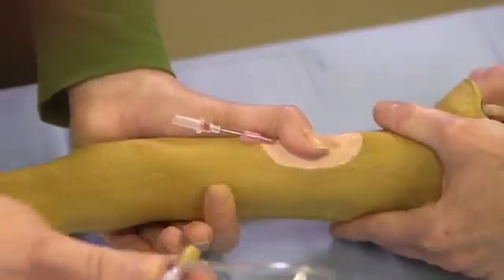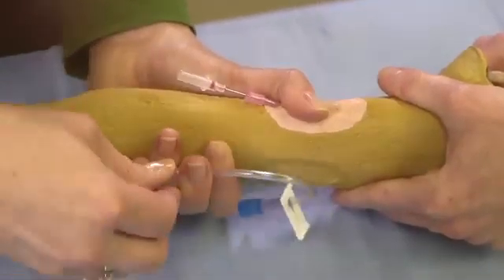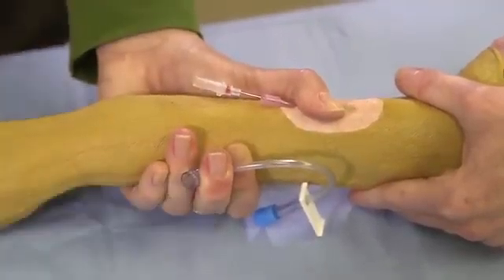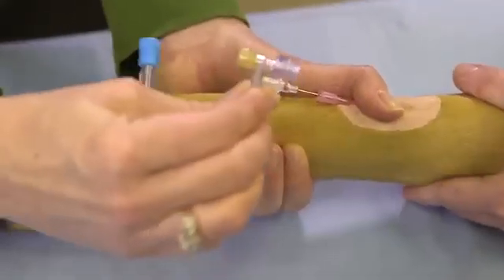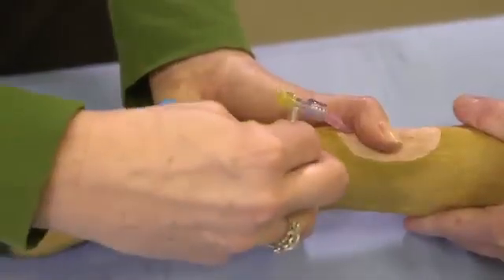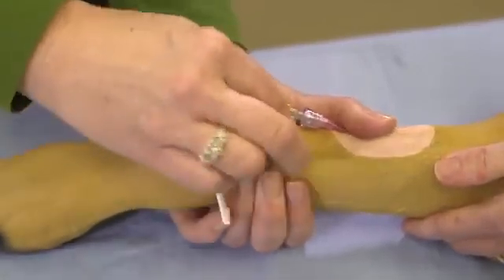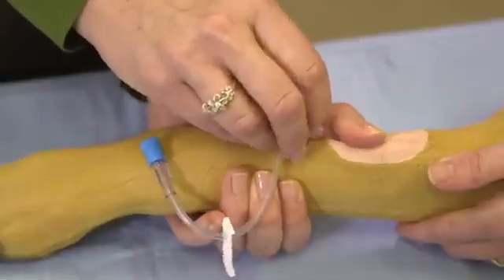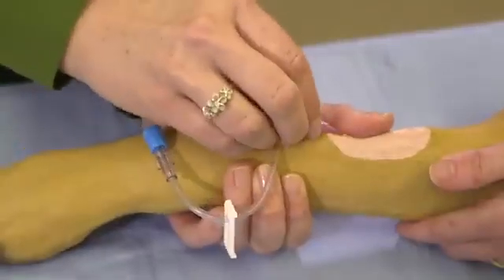This is my T-port. It's going to have a protective cover on here. So I'm going to take that off. This is sterile. Don't let it touch anything. You're going to have your T-port ready so that when you pull your stylet out, you can place your T-port on if that's what you're using. This one has a screw on top, so you have to carefully screw that onto your catheter while keeping everything still. This can be a little difficult.